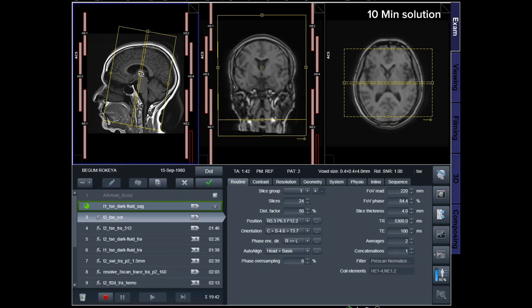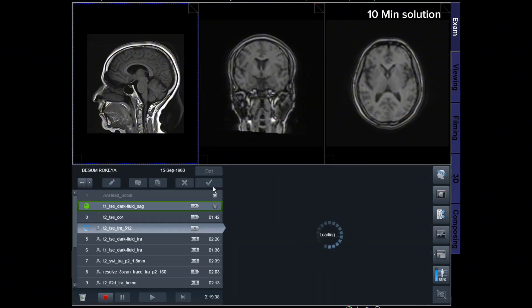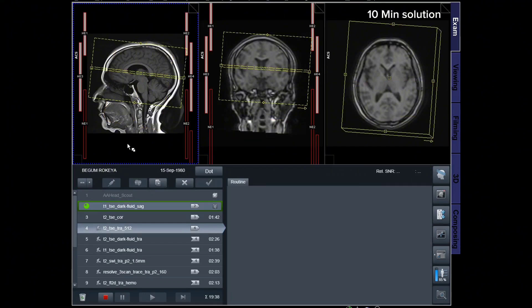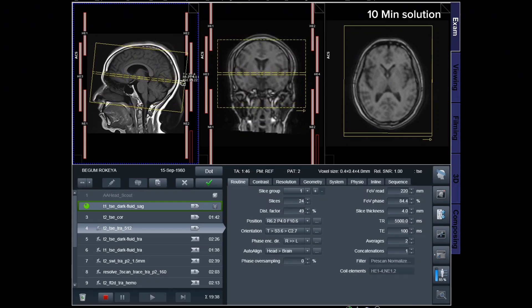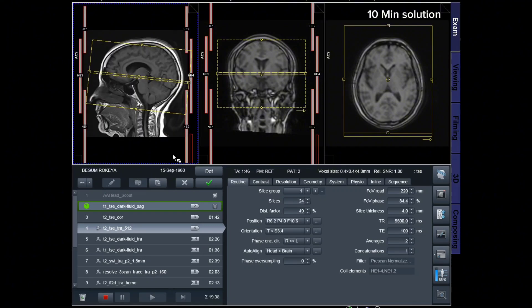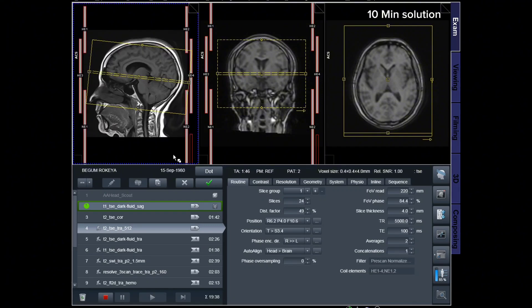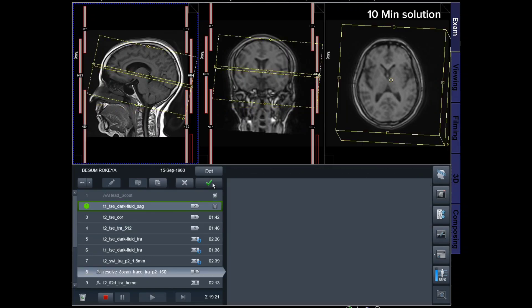The number of slices should be sufficient to cover the entire brain from the frontal sinus to the occipital protuberance. For T2-TSE axial, position the block on the sagittal plane parallel to the genu and splenium of the corpus callosum. Ensure that the number of slices is sufficient to cover the entire brain from the vertex to the line of the foramen magnum.